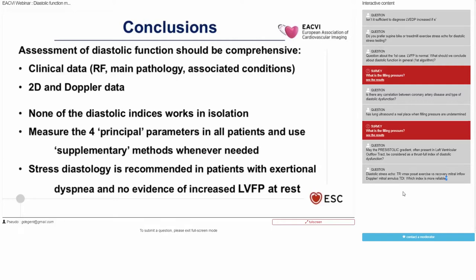And again, do not forget to use stress diastology, which is recommended in patients with exertional dyspnea who do not have evidence of increased filling pressure in resting conditions.